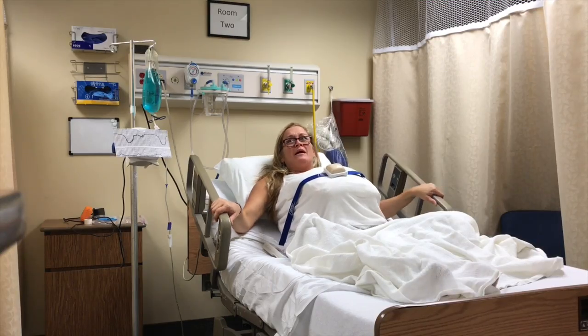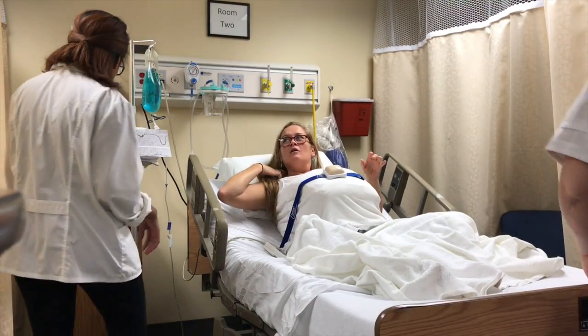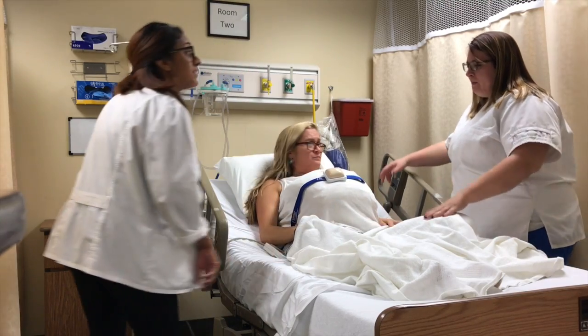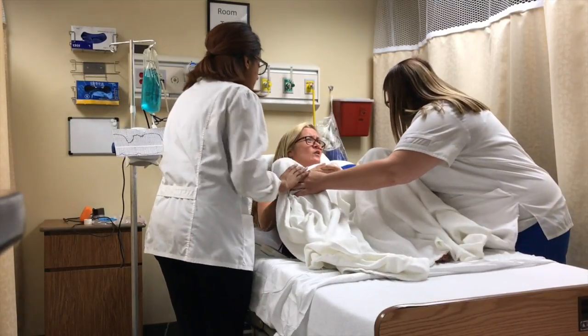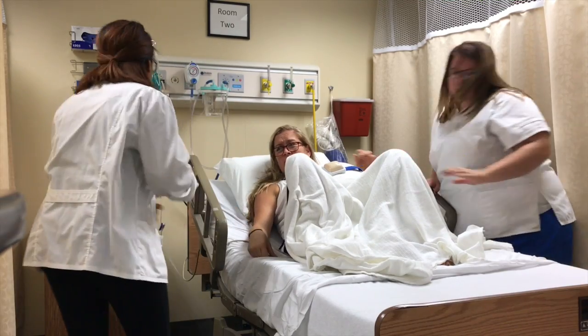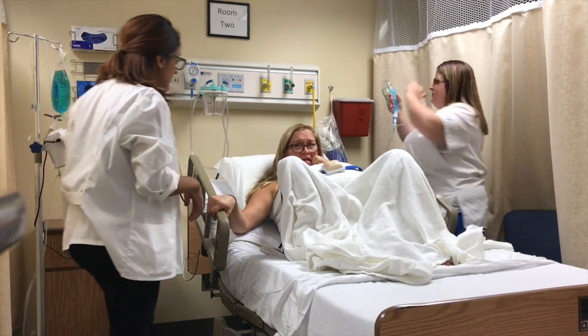Beep, beep, beep. Oh my gosh, doctor, nurse, something's happening to the baby. Hi. It looks like your baby's heart rate is at 90 beats per minute. She's having variable deceleration. We need to put your knees to your chest right away. I don't know if I can. Knees to chest. All right, I'm gonna discontinue your pitocin. That's only making it worse. We're gonna administer your oxygen as well. Is that for me or the baby?